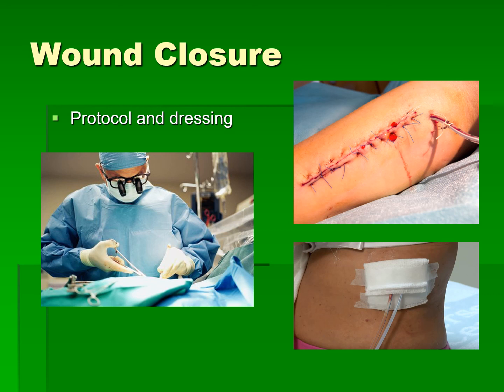Once you've placed the dressings, then you're going to move your stuff back, and then you're going to keep that sterile. You'll help take the drapes off like we've been doing in our lab practices.